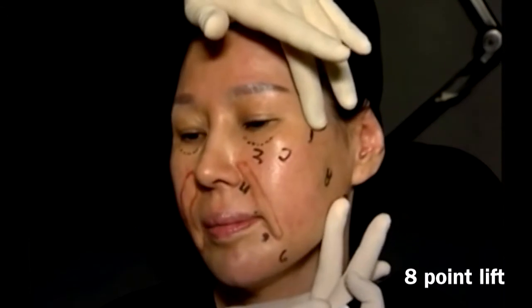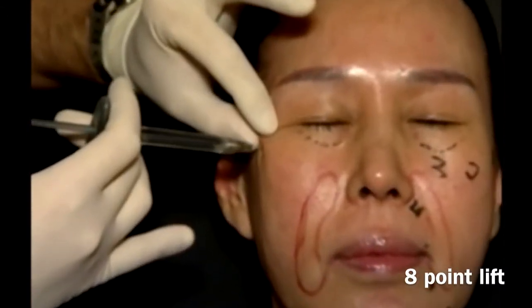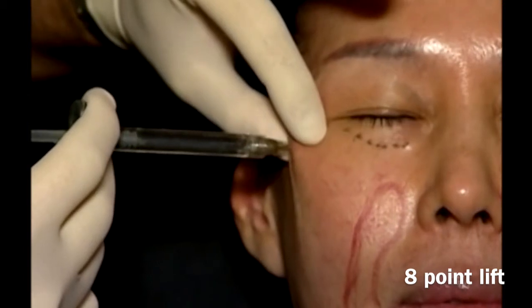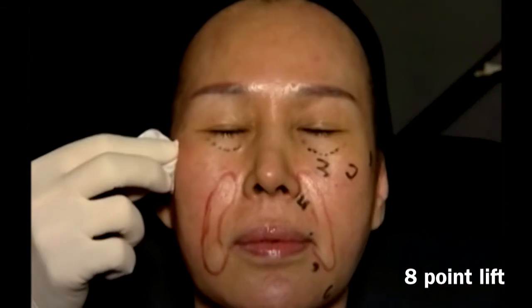Stretch out and proceed with the injection in point number 1. Don't forget to aspirate. Perpendicular, down to the bone. A total amount of 0.1 is injected. Massage.